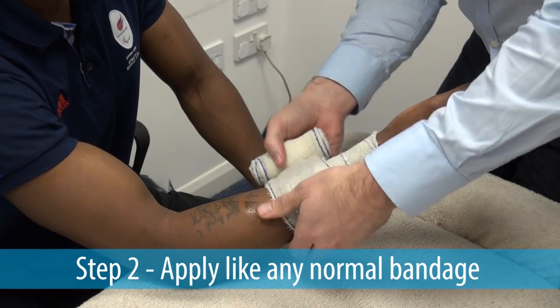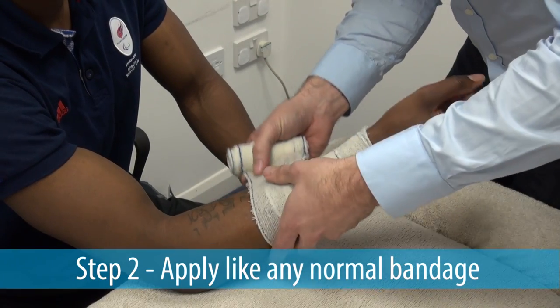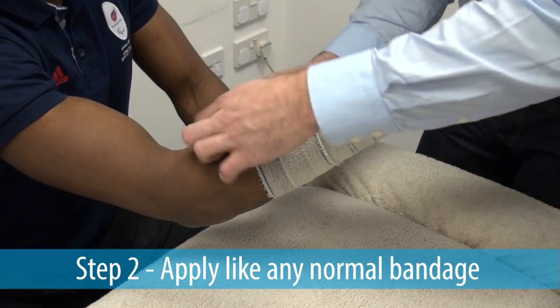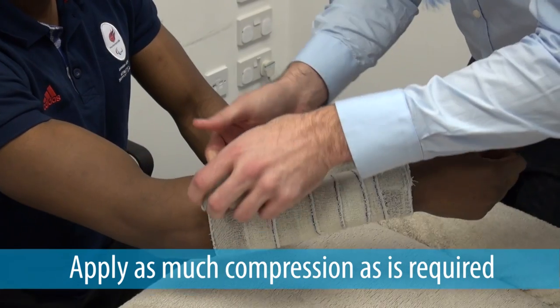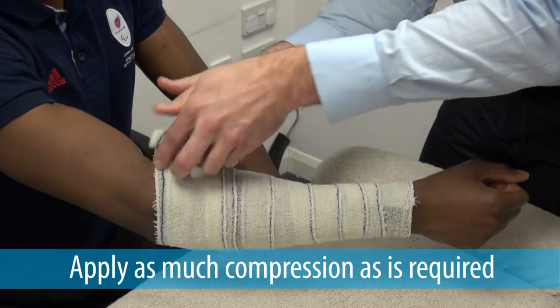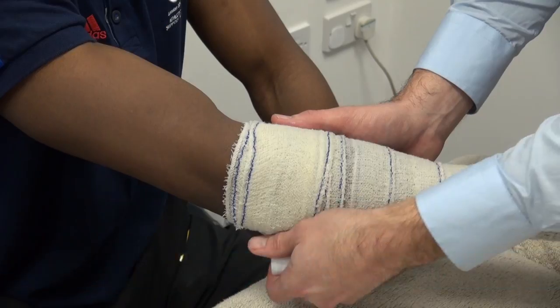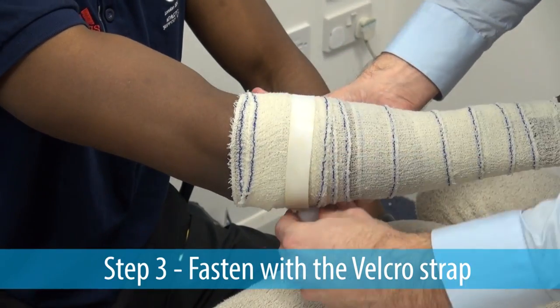The bandage comes out of the packet slightly cold and slightly damp. You can extend the bandage as far or as long as you want to, and you can pull it as taut to apply as much compression as is required. Fastening with a velcro strap at the end, application is quick and easy, as the bandage holds itself in place.